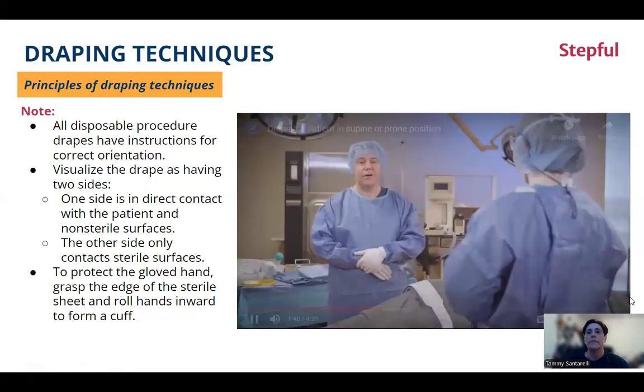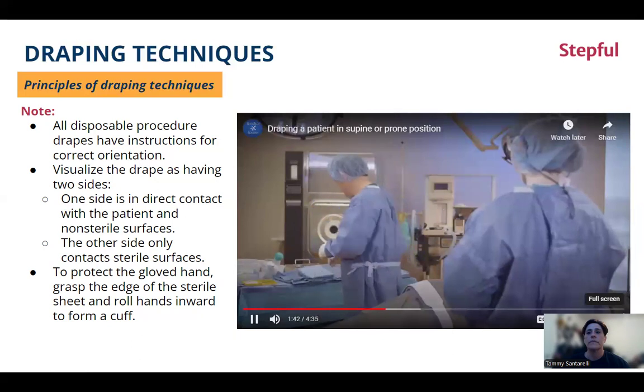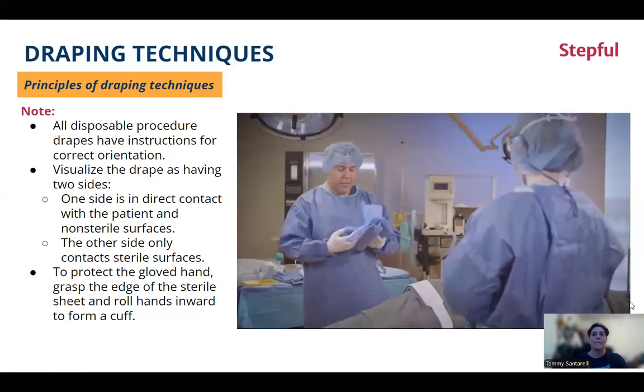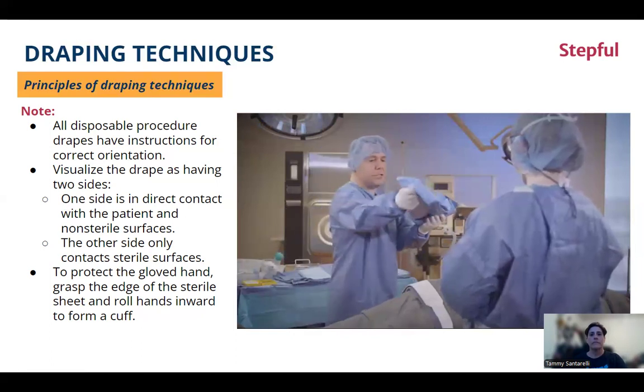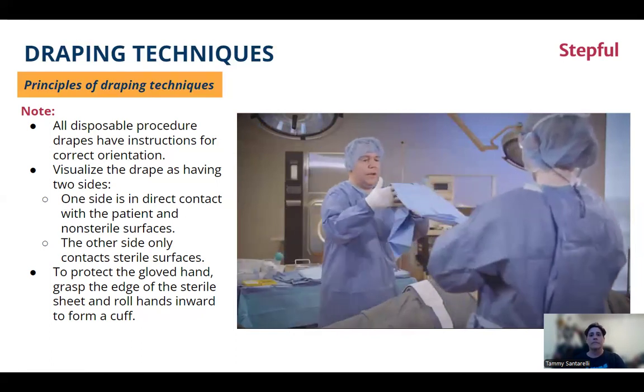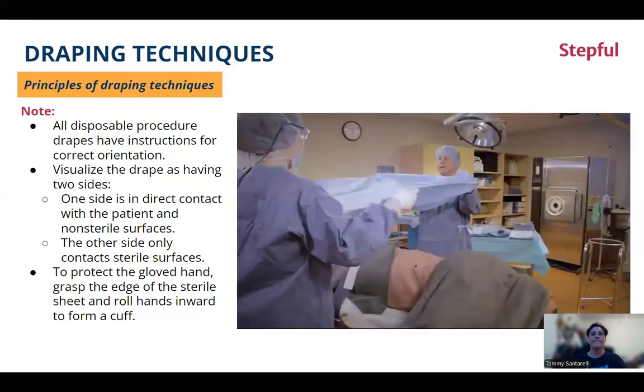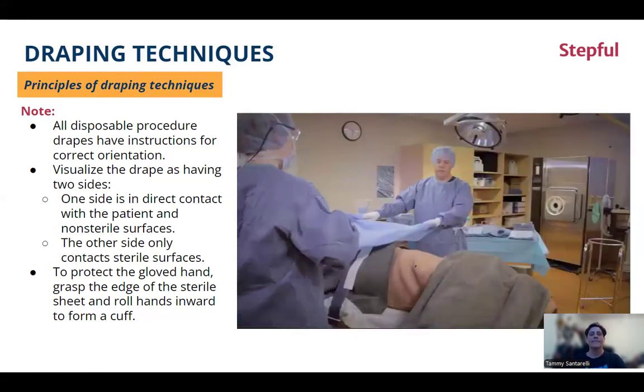All right, so first thing are the medium sheets or half sheets. So I'm going to bring my medium sheet up. I'm going to pass half of it to the surgeon. And we're going to drape the inferior patient. We're going to extend, make a cuff, and drop.